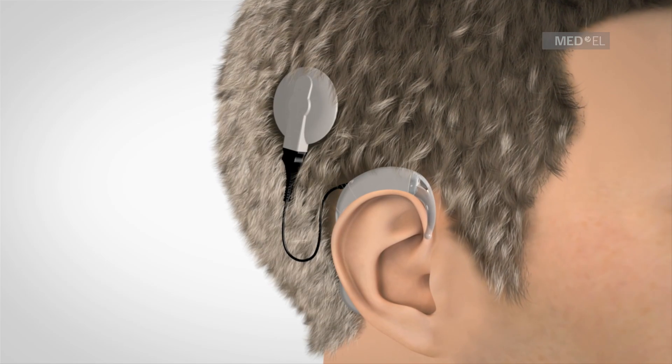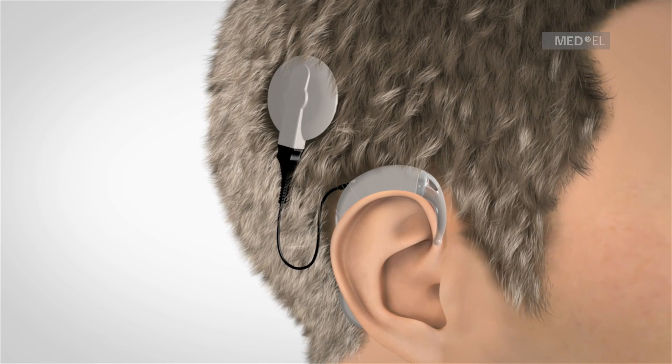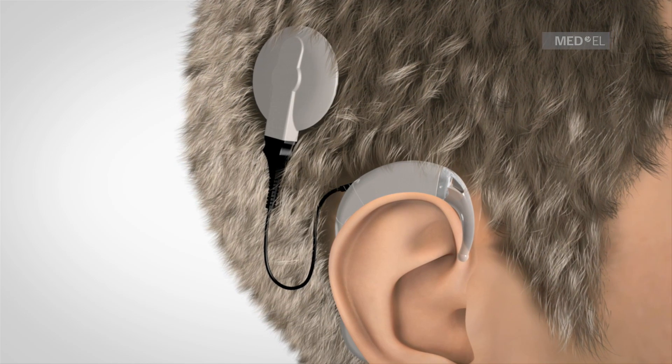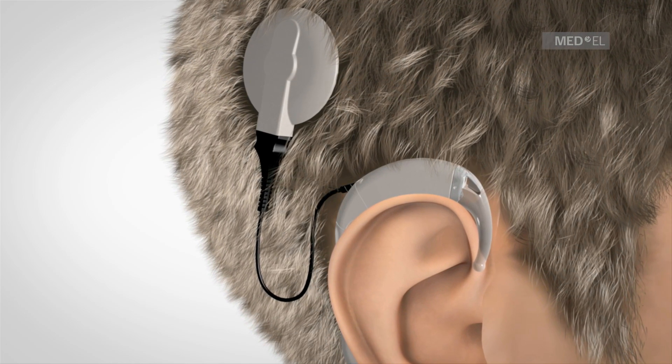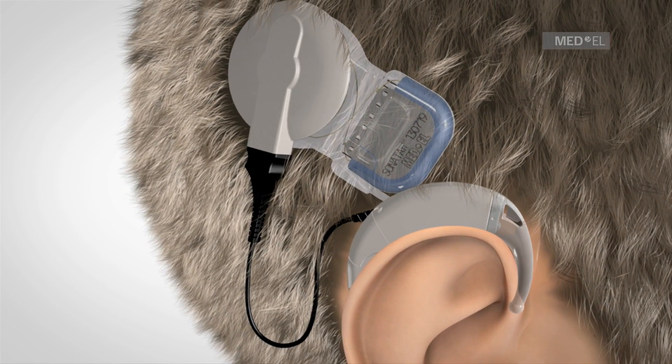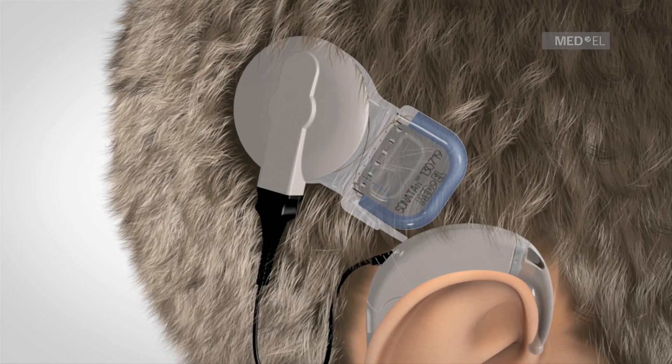The Maestro Cochlear Implant System was developed for individuals with severe to profound sensorineural hearing loss. The Maestro CI system consists of an audio processor, a small device worn behind the ear, and an implant which is surgically placed under the skin.